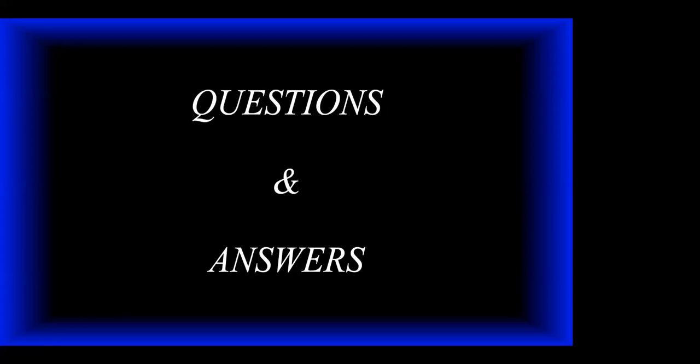Thank you. So what is the minimum length of an implant that can be placed in the posterior mandible, posterior to the mental foramina? What is the minimum length of the implant? Okay, well, that's a difficult question to answer because there are so many variables. But let me try to answer it this way.